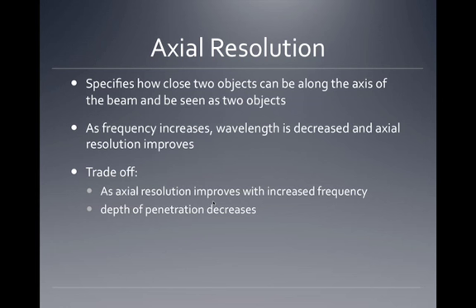Okay, so again, resolution. If we have the higher the frequency, the better the resolution. And what we're talking about here is being able to distinguish two small objects. Okay, if we don't have good resolution, two objects close together are going to look like one thing. And so as our frequency increases and that wavelength decreases, we're able to distinguish the smaller and smaller objects and tell that there's two things there instead of just one.